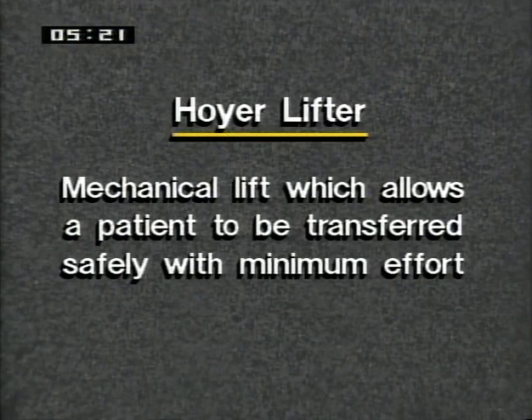We'll again watch Tom and Judy demonstrate as we present the step-by-step instructions. Let's start with the Hoyer lifter, more commonly called the Hoyer lift. The Hoyer lifter is a mechanical lift which allows a person to be lifted and transferred safely with a minimum of physical effort. A medical equipment company will provide the Hoyer lifter to the patient.